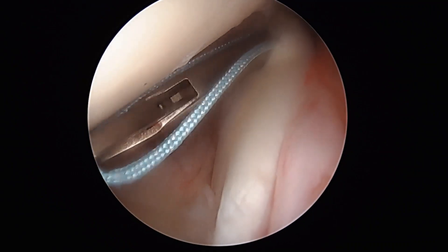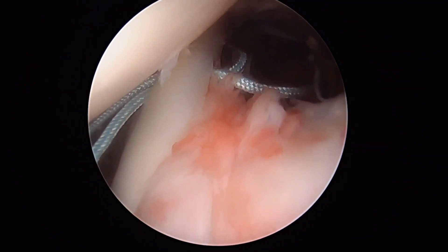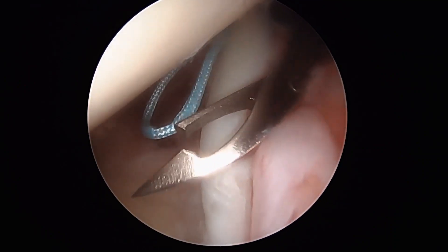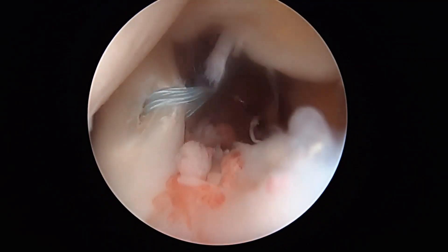The biceps is pierced with a bird's beak loaded with a loop of Dynacord. The loop of the Dynacord is captured by the bird's beak after piercing and brought extra-articular, where the tails are placed through the loop.